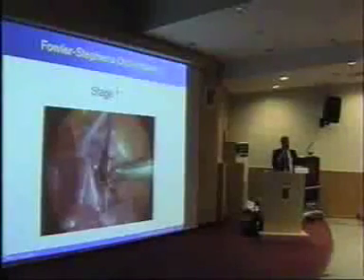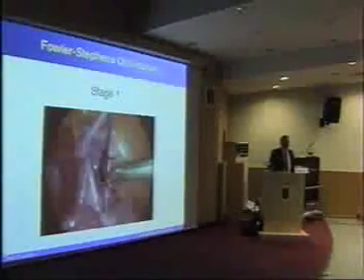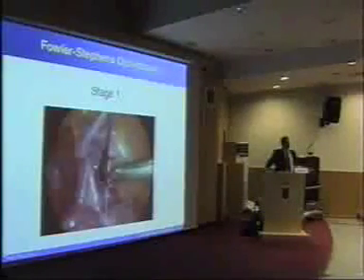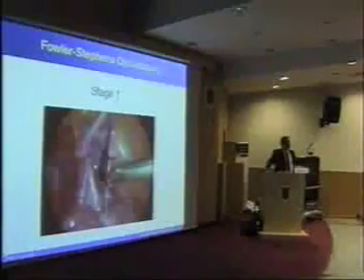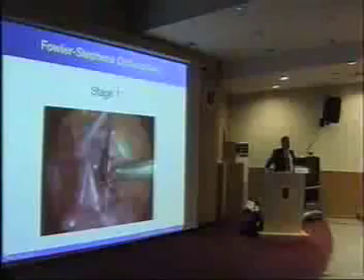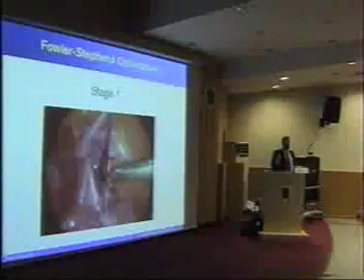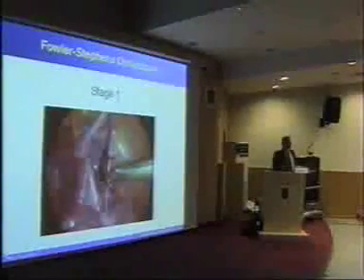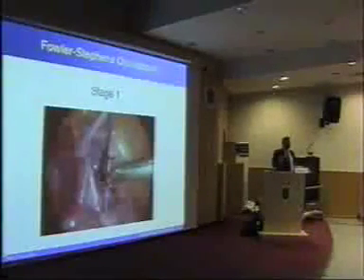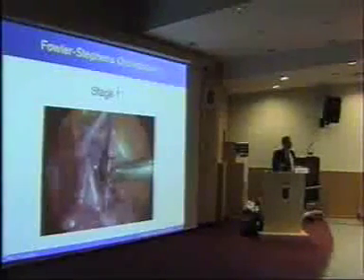Okay. Well, I think it's important to try. The general surgeons have really had an advantage here because they've had patients with non-specific abdominal pain or possible appendicitis. And this is a great group of patients. Maybe they see 4 or 5 of these patients a week, where the laparoscope confirms a diagnosis. Okay, appendicitis is a clinical diagnosis, but actually there's nothing to be lost by doing a laparoscopy before your appendicectomy, is there? And so they have a ready group of patients which they're immediately able to apply laparoscopy to and learn the basic techniques very quickly. And then they're able to take those patients on to the next stage and start to explore the removal of the appendix, and those surgeons now take them all out laparoscopically, don't they?